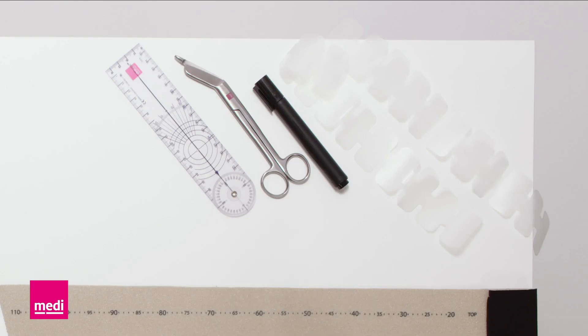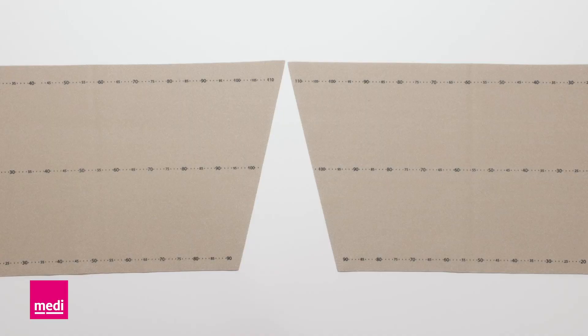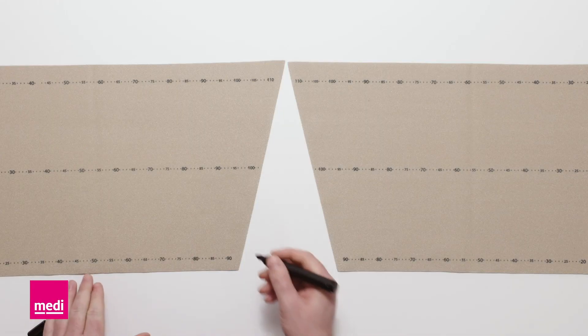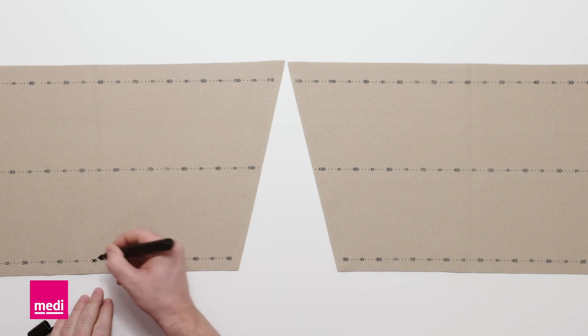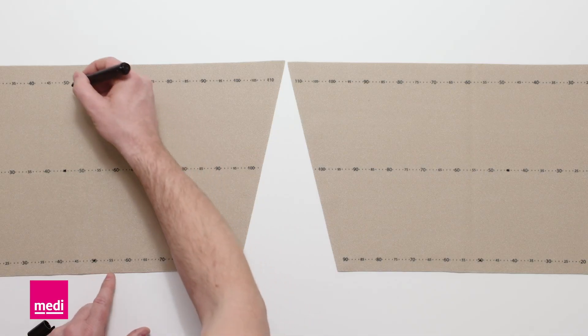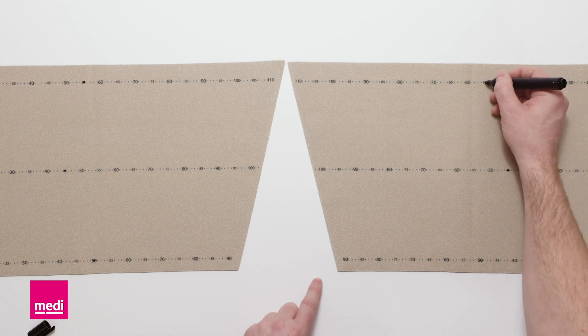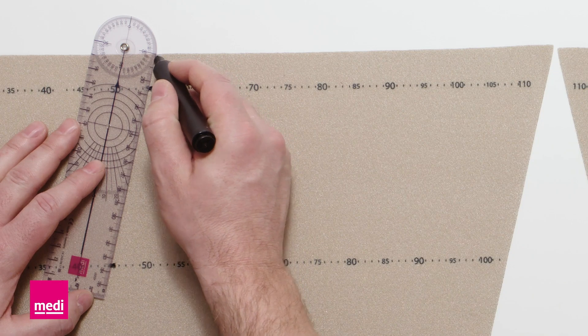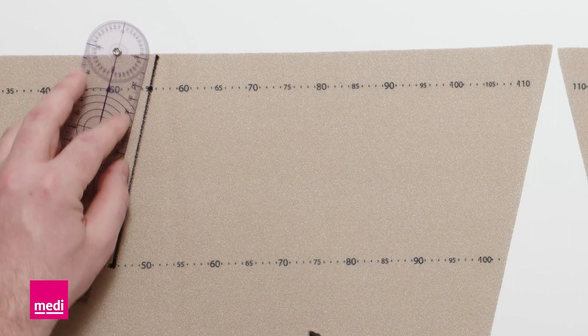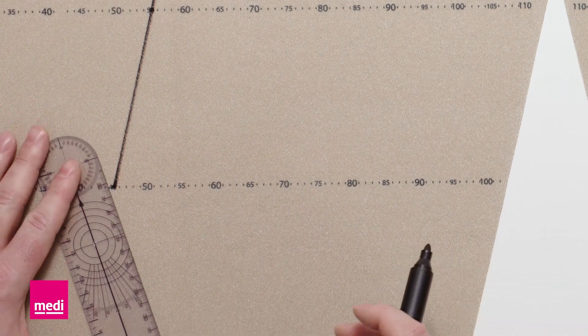The two components are connected with the spine. First, mark the calf circumference C at the bottom, the knee circumference E in the middle, and the thigh circumference E2 at the top. Connect the points and cut both components along the plotted line.